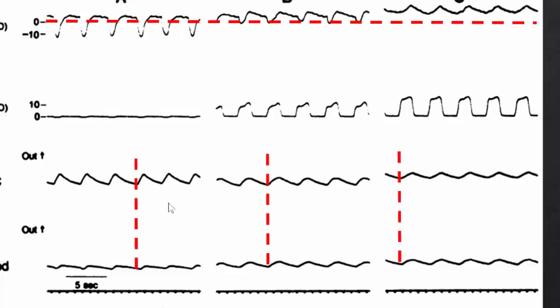This is a little hard to see, but I drew some vertical lines. In this first patient who's working hard, you can see some dyssynchrony and what's really abdominal paradox, where the abdomen is moving at a slightly different timing from the respiratory chest wall. As we raised pressure support, these two became simultaneous. So this first graph is really a visual representation of abdominal paradox.